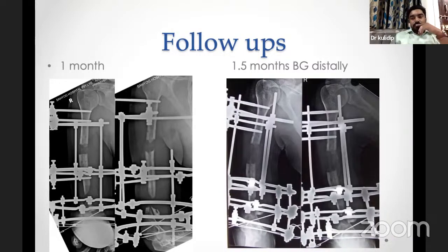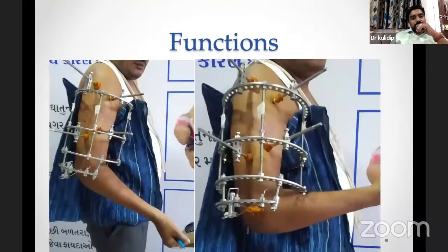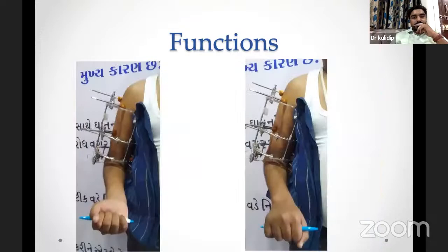Once it came down, I was not able to open well because of the 2 rings at the distal smaller fragment. So with the posterior approach, I went up to the non-union site and put in a graft. I was not happy with the graft placement and the visualization. But he was functionally okay. He was getting some range of elbow motion, and supination and pronation, you can appreciate.